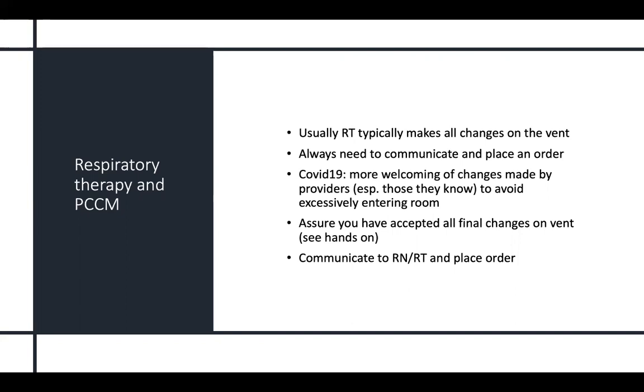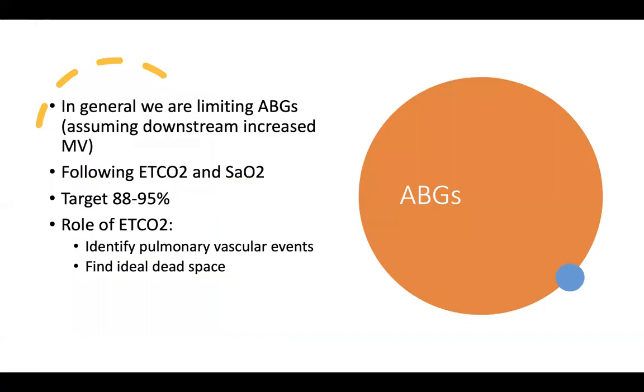So be very careful that as you leave the room the patient is on the ventilation and the settings that you want. And then communicate changes to the nurse and the RT and place the order so that we can make sure that everyone is comfortable with ventilator management.